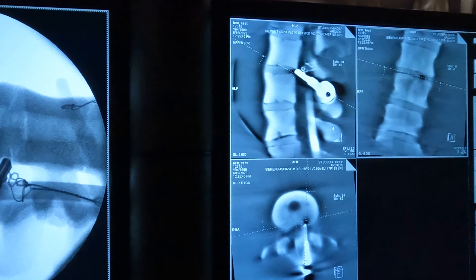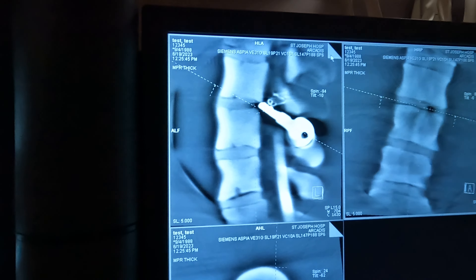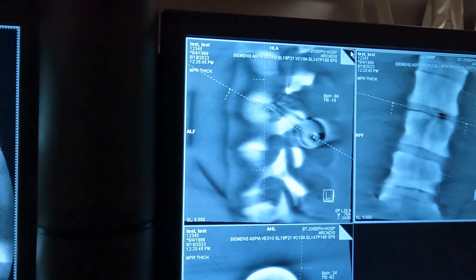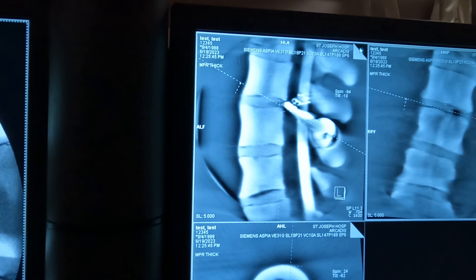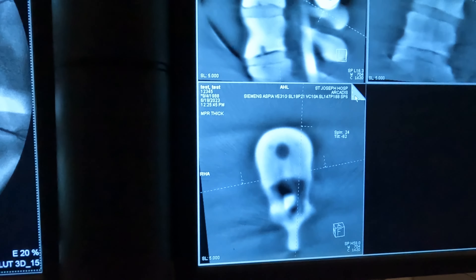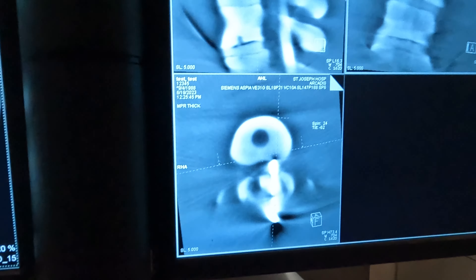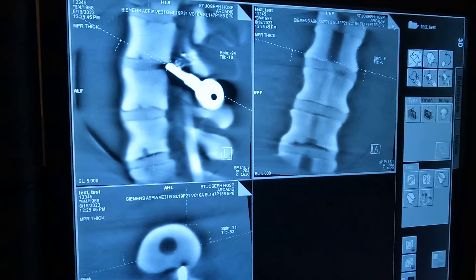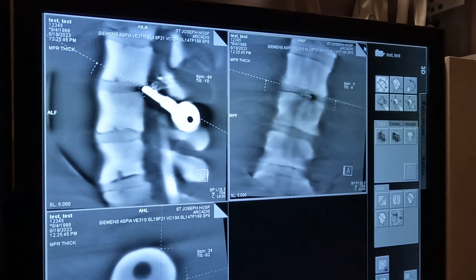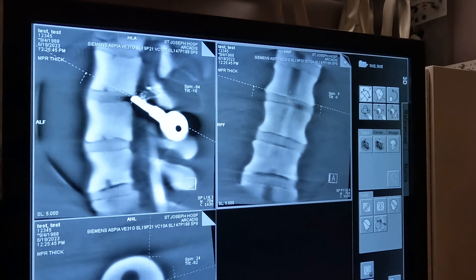The surgeon will ask you to flip through different images. To look through the lateral, you'll use what they call the dog ear at the top — hold it down one way, hold down the other to go the other way. He'll also ask you to flip through the axial projection the same way. He may also ask you to hold down the oblique view and flip through. That's pretty much it for looking through your images.